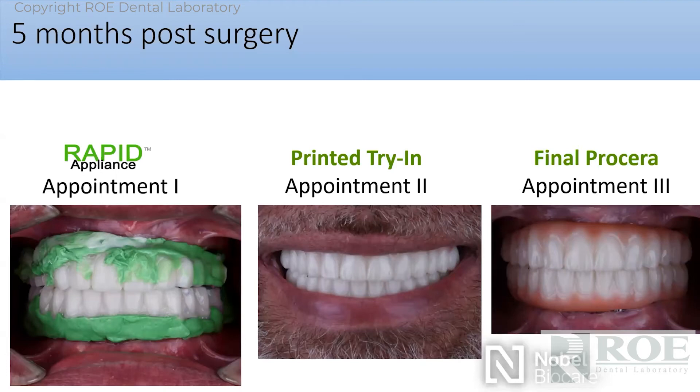Here's the first appointment at the restorative part: seat the rapids or reline the long-term prosthetic, do bite registration and equilibration, and send it to us. The second appointment is a try-in. Dr. Kiefer adds a little bit of pink to these try-ins, so they're just beautiful.